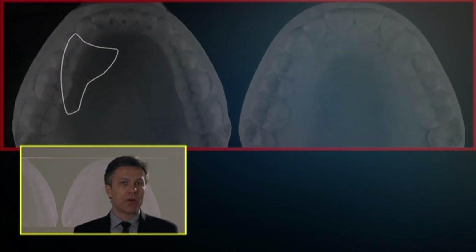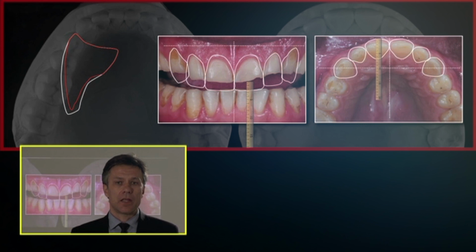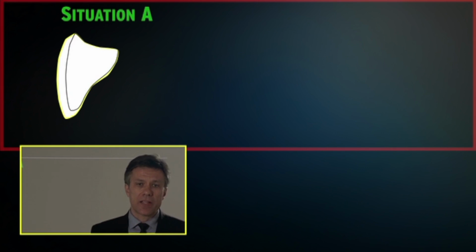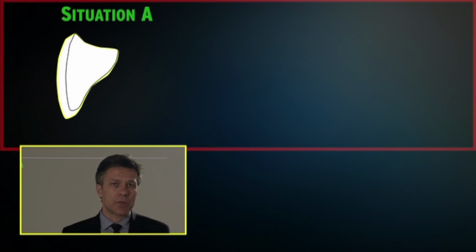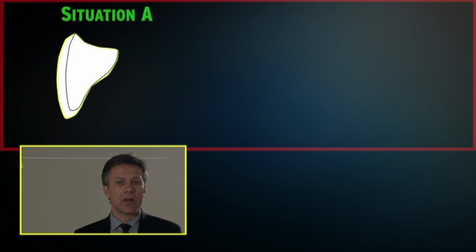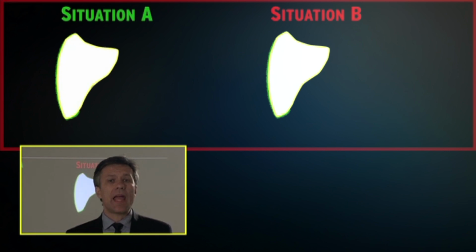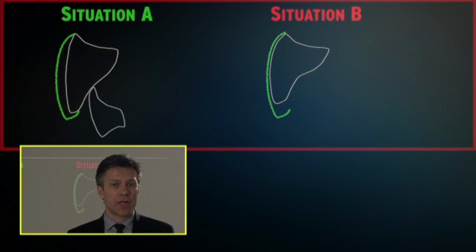We do first of all the buccal wax up, and those are the reasons that we do the buccal wax up. I orient the technician on how much to do, and you have to remember that different situations lead to different results. For example, in situation A, you have to increase just a little. In situation B, you have to increase more than this, like 2 millimeters, 2.5 millimeters.